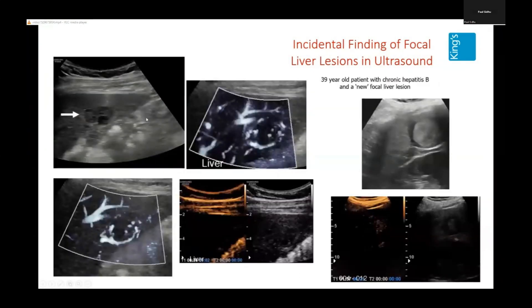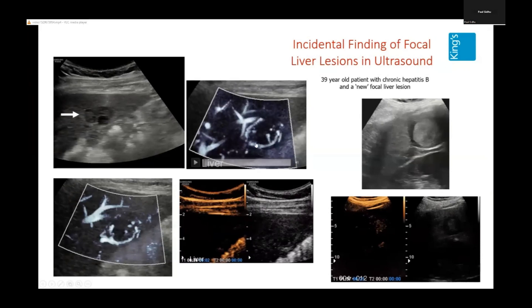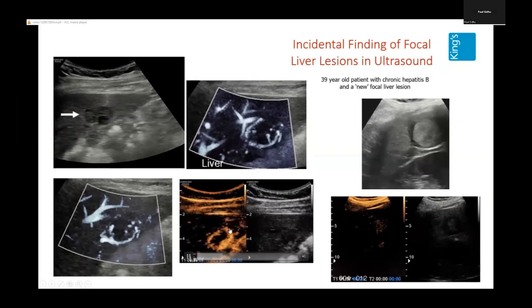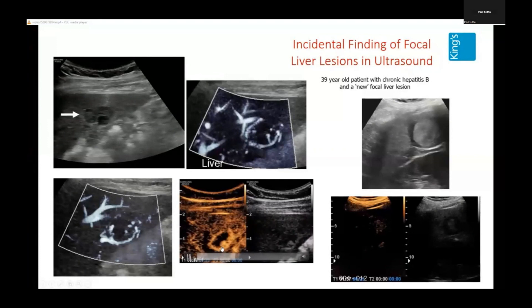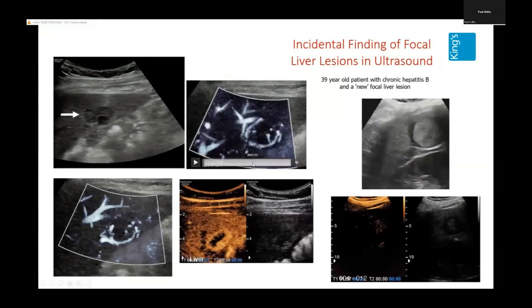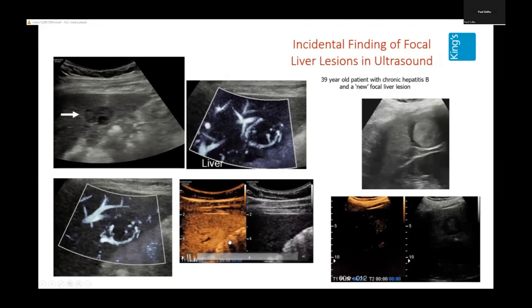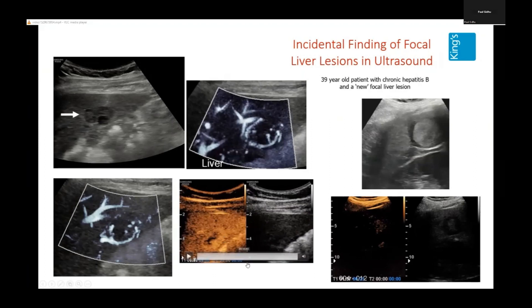Here's another patient — a 39-year-old with chronic hepatitis B and a new focal liver lesion. We also used microvascular imaging, which gives beautiful imaging of peripheral globular enhancement around the lesion. You can see how contrast-enhanced ultrasound reassures you this is a hemangioma as it infills. Microvascular imaging is almost like a snapshot of only the arterial phase — if you suspect malignancy and want to know whether it washes out, you still need your full contrast-enhanced ultrasound.